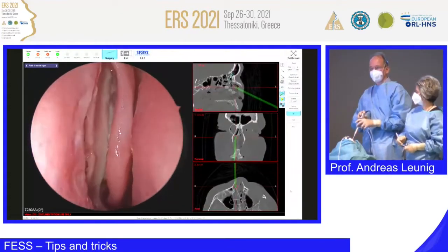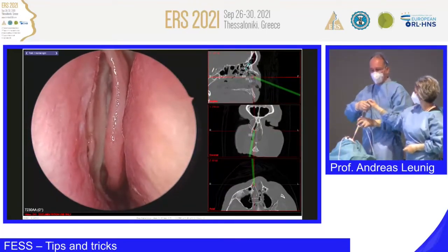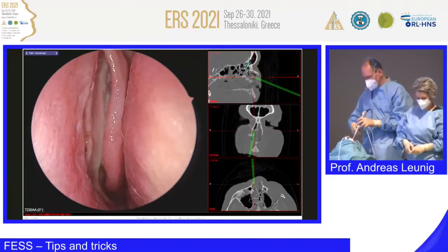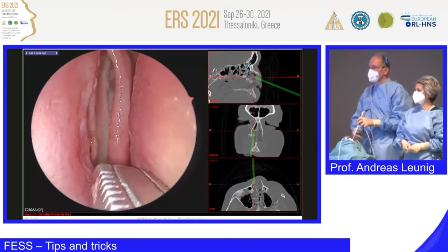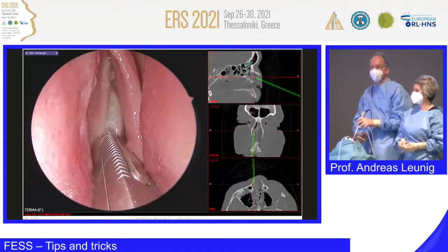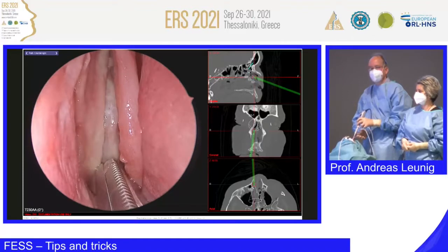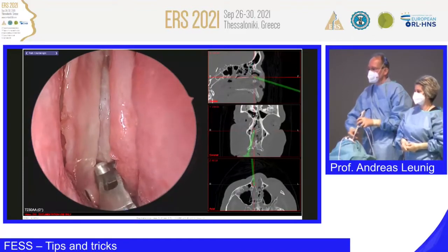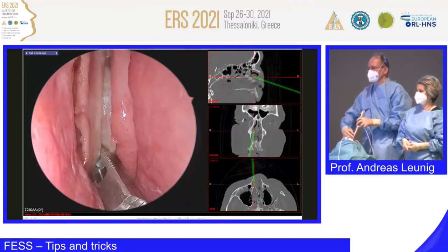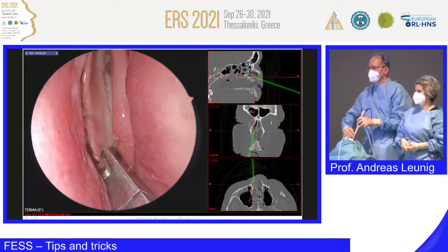Okay, so now I show you the backbiting technique, the swinging door. The backbiter. Let's assume we did not use the anterior technique. Just place it back. You can't see anything. I go in again, very gently, trying not to damage mucosa. Now you slip behind the uncinate process and you use your backbiter and you cut through like this.